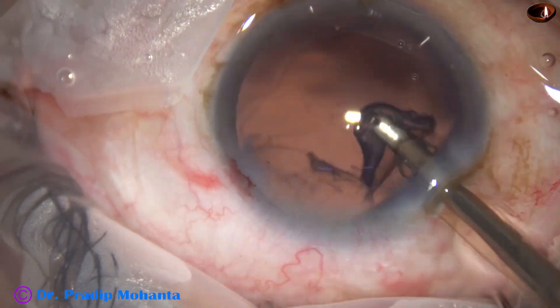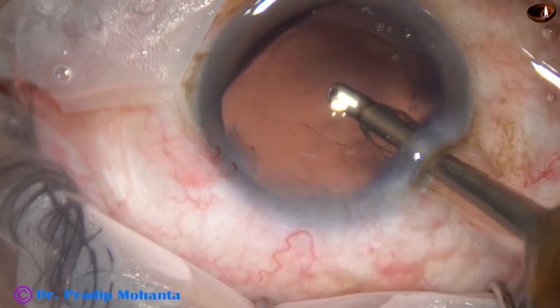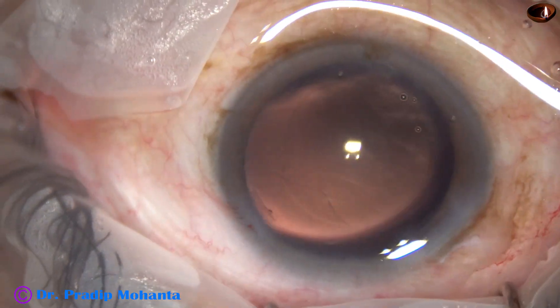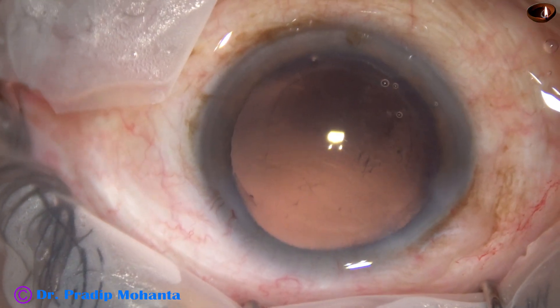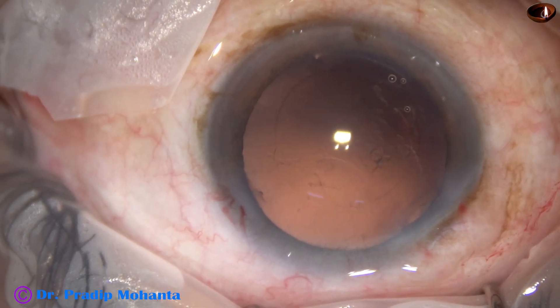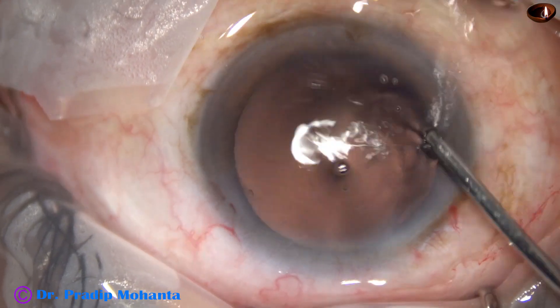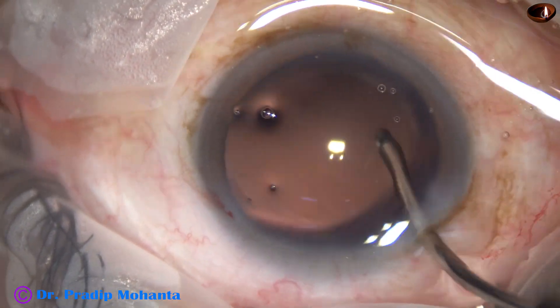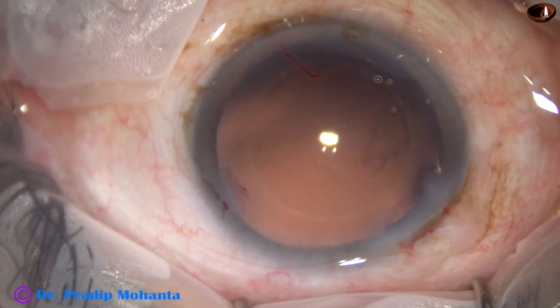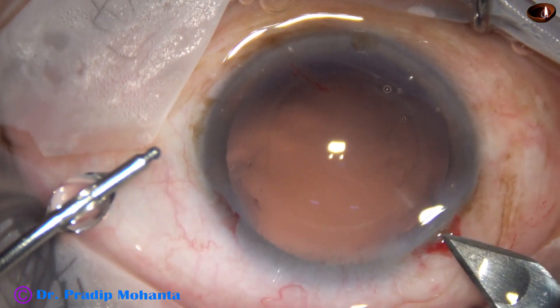So this is the removal of cortex by coaxial irrigation aspiration. It is done. But there are some lens fibers sticking to the posterior capsule. Now let us see hydro polish. Hydro polish means the irrigating probe of bimanual IA goes in, and the irrigating jet or fluid is swept over the posterior capsule.